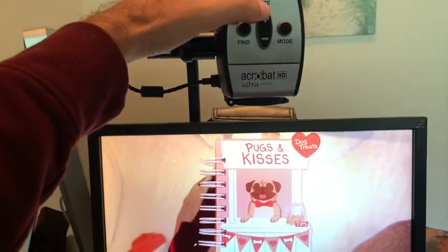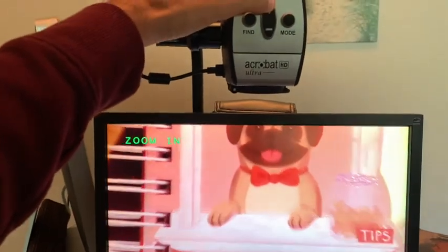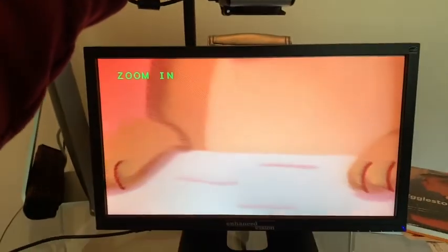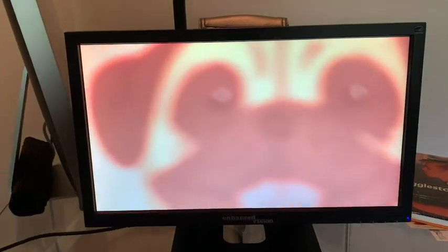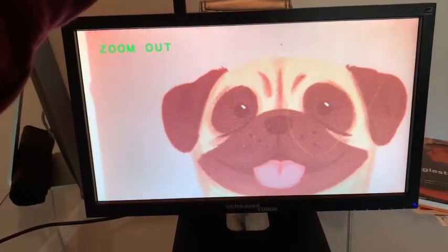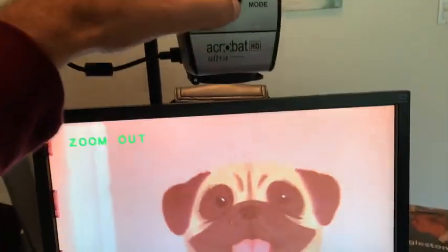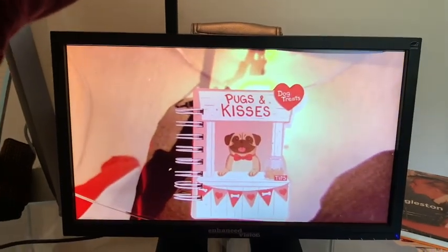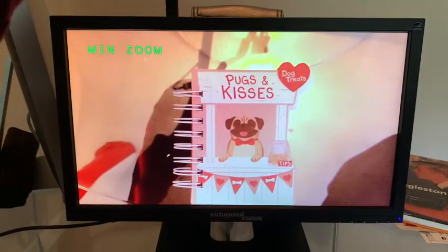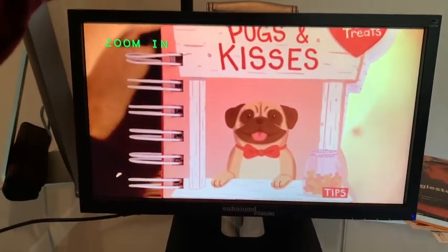Press plus for increasing magnification. You may need to move the material too as you increase magnification. To decrease, press minus. Let's go somewhere in the middle — something like that.